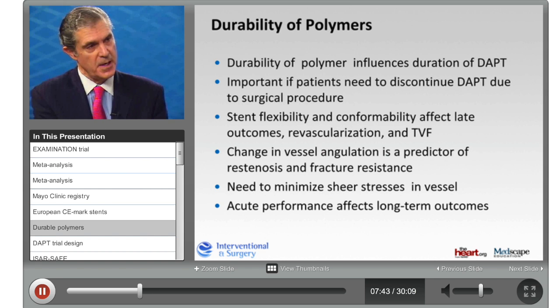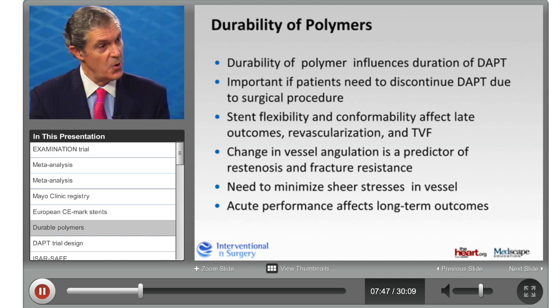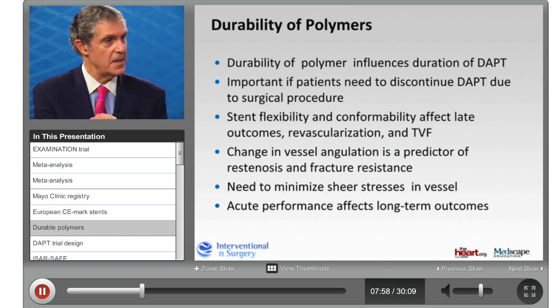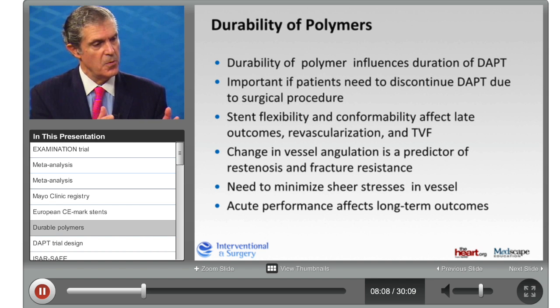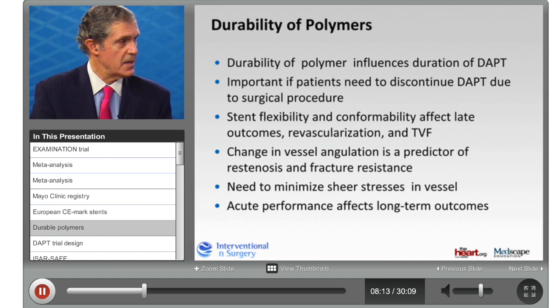And I got to look very carefully at polymer load and the rate of bioabsorption, how long it takes. Almost every one was 6 to 9 months, some over a year, and some of them had larger loads, which is one of the determinants of that. And clearly the shortest, meaning the thinnest, 4 microns with bioresorption within 3, possibly 4 months, was Synergy. And so that model, PLGA, best polymer is one that does its job and it goes away. That would be a great concept.